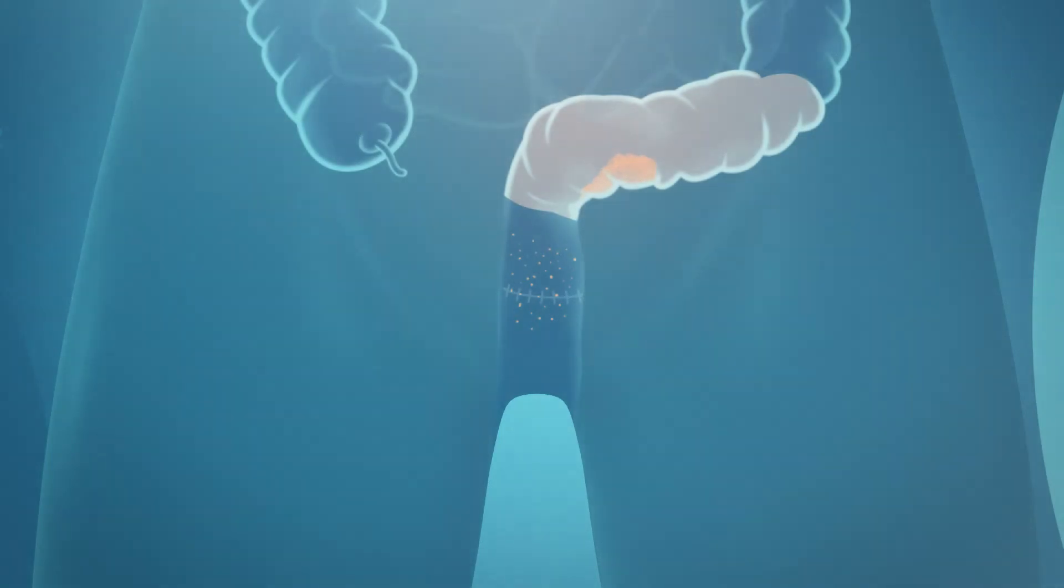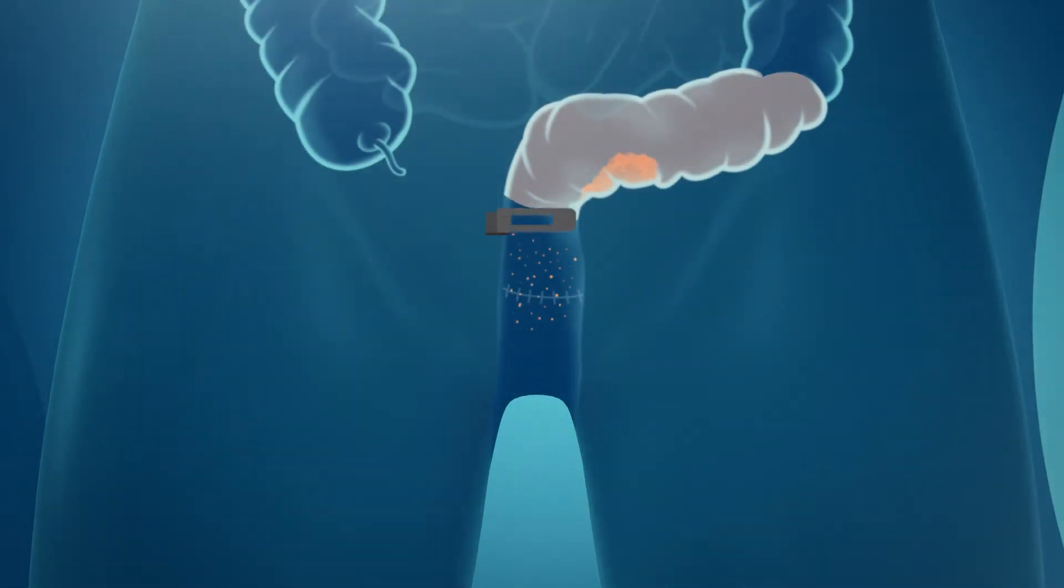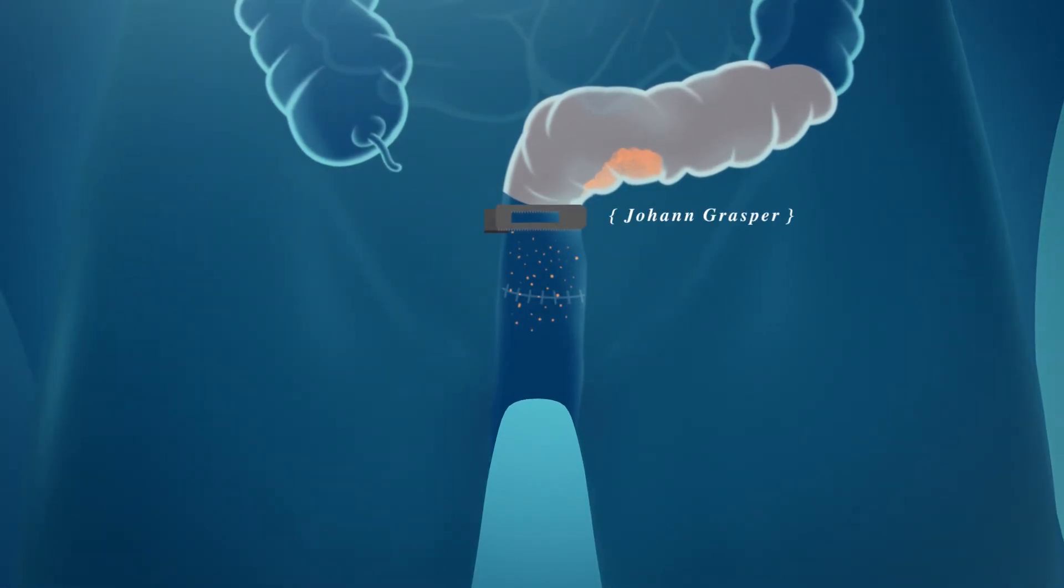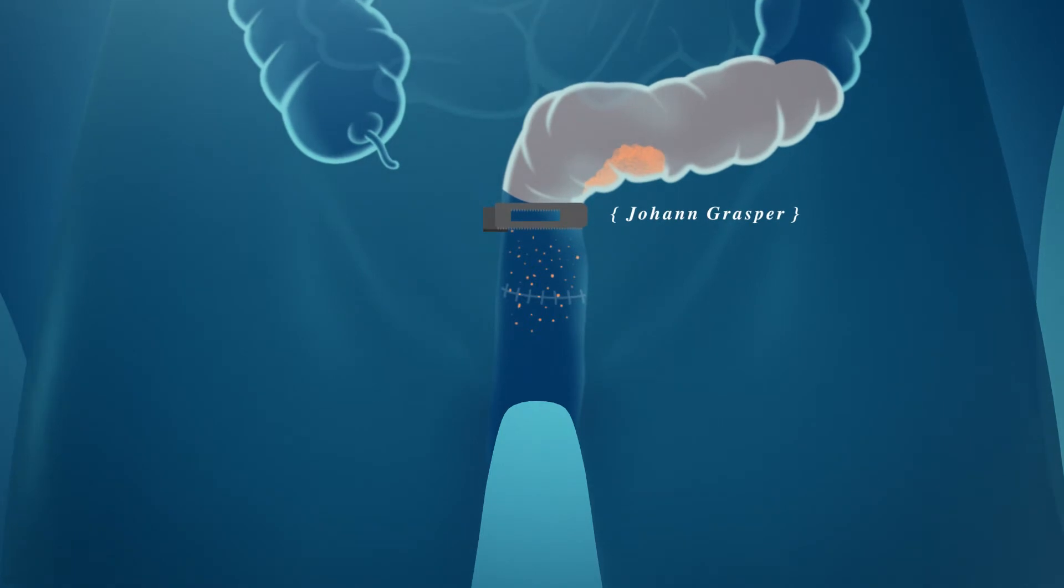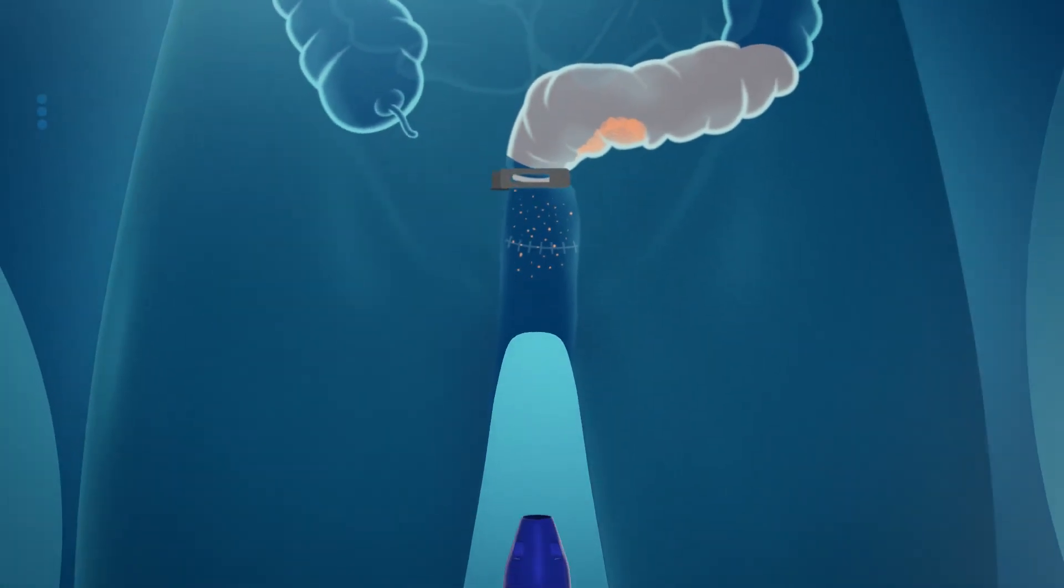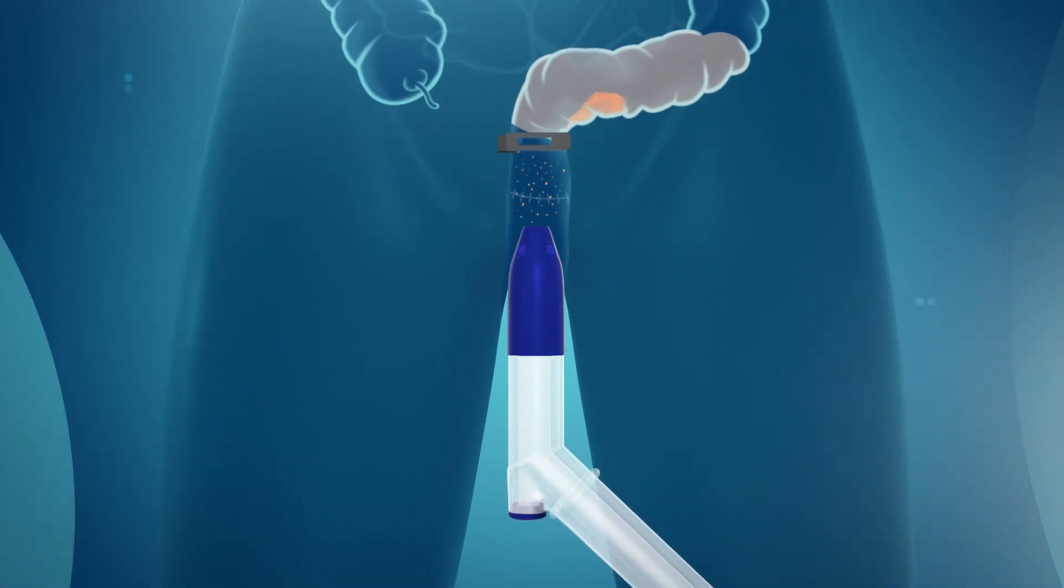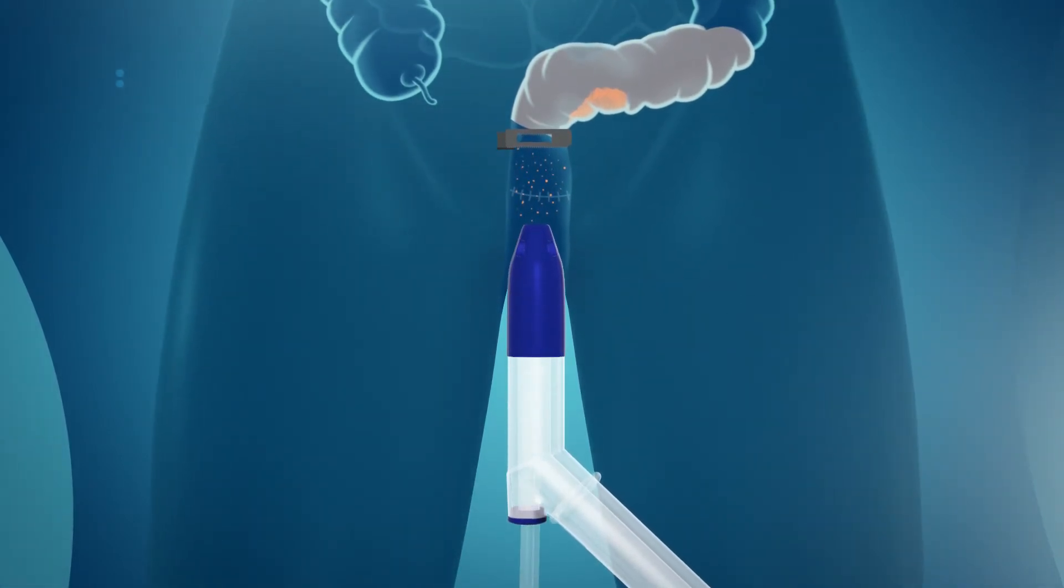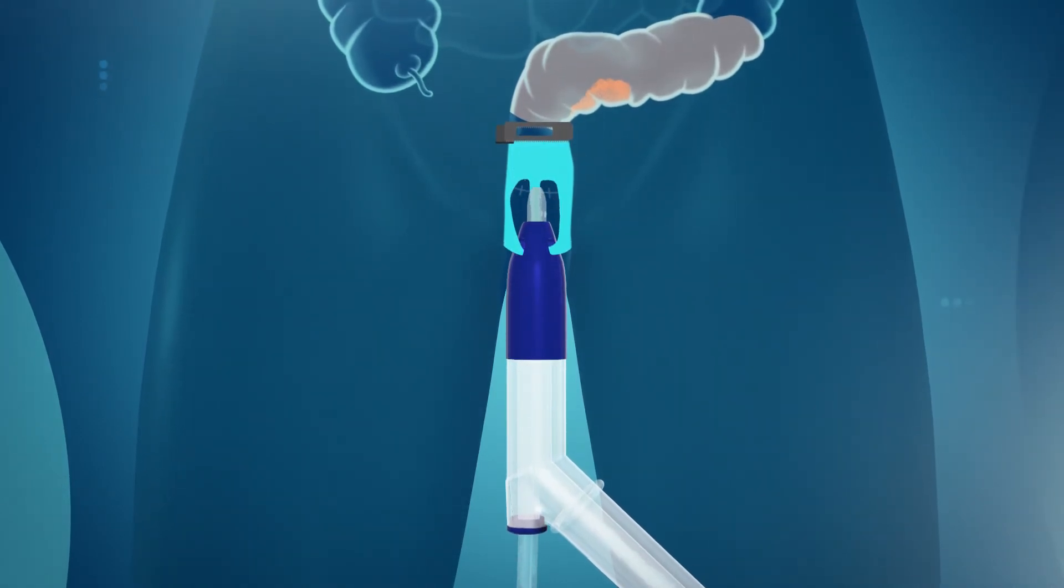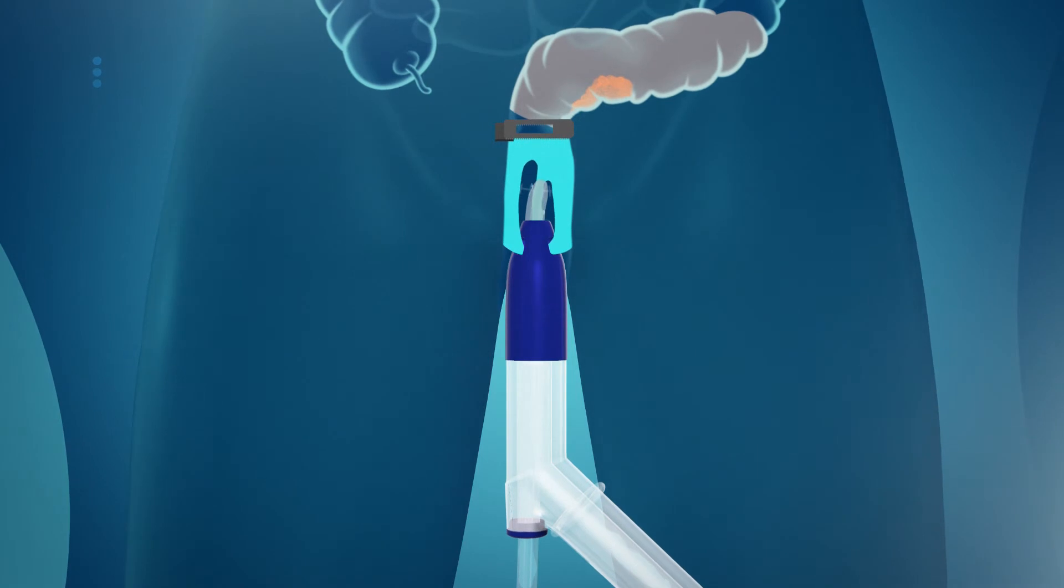In use, the rectum is clamped above the proposed suture line. In laparoscopic resections, this can be done quickly and easily using a Johan Grasper or a simple nylon tie. The ProctorWash is inserted, a fluid bag is spiked, and the irrigation tubing is advanced through the device. Irrigation commences when ready and can be directed anywhere within the rectal stump.